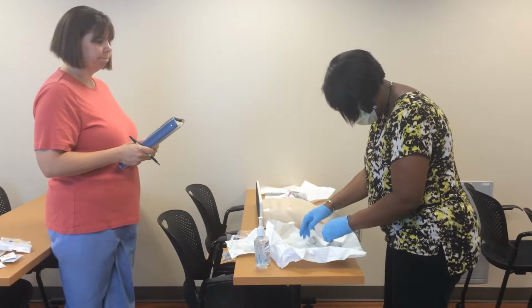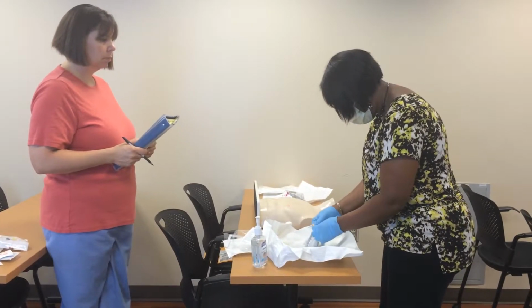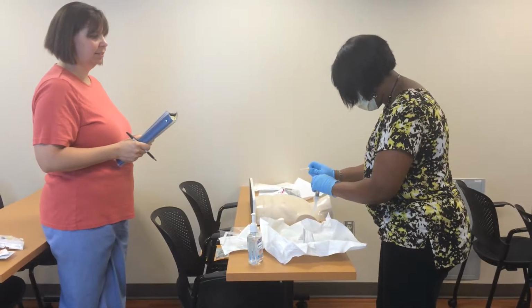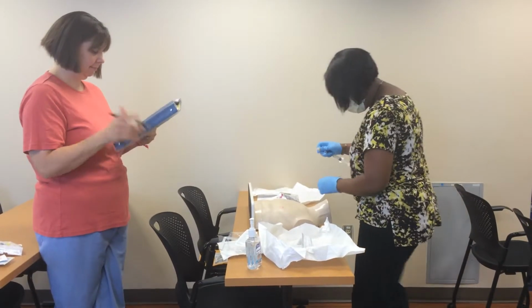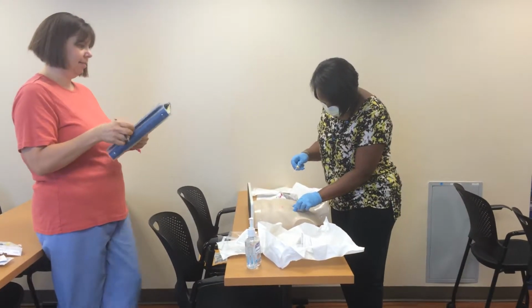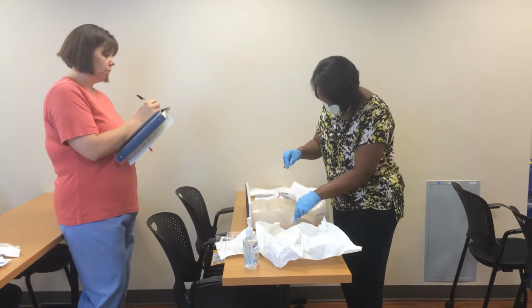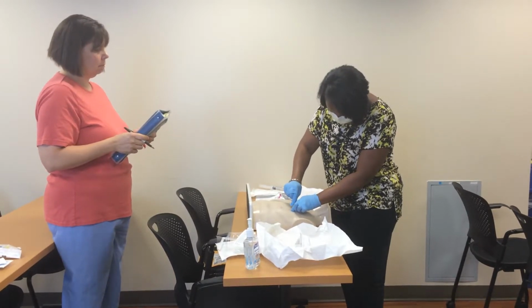Okay. Now, I'm ready to access your port. Feel me come over here. Take a really deep breath in and a deep breath out. 1, 2, 3.